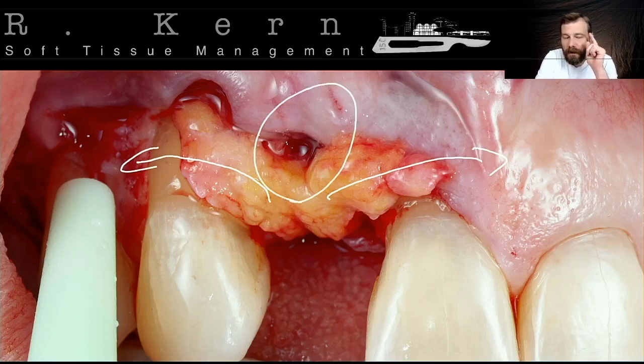Remember when we saw the initial case on the occlusal view? So that margin, that area, there's no lack of volume, okay? I do not need to overgraft this area. That is the first point. Second point, the center is usually an area where we're never going to struggle to graft and achieve the volume that you want.